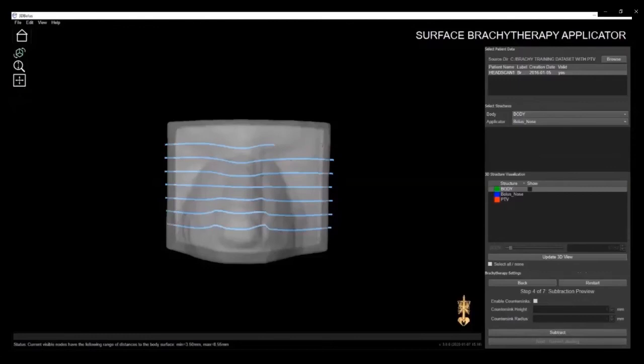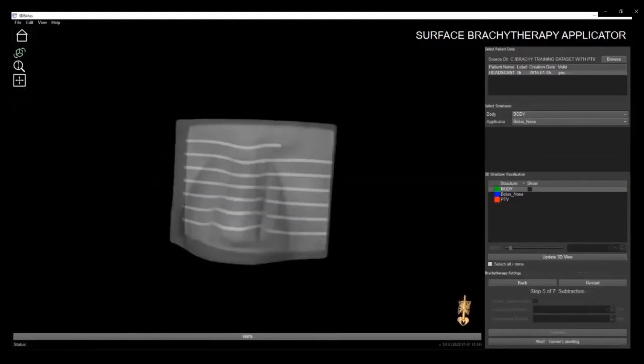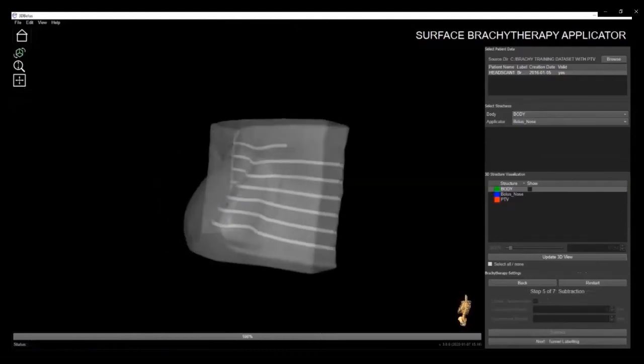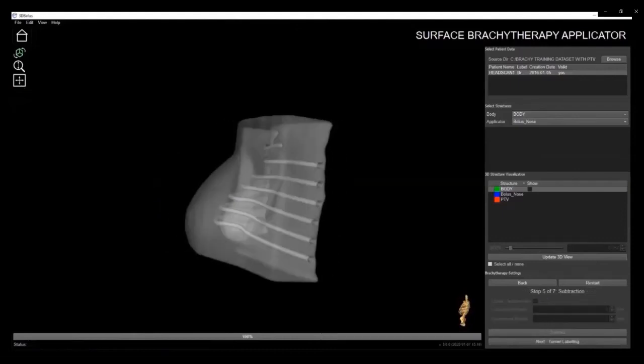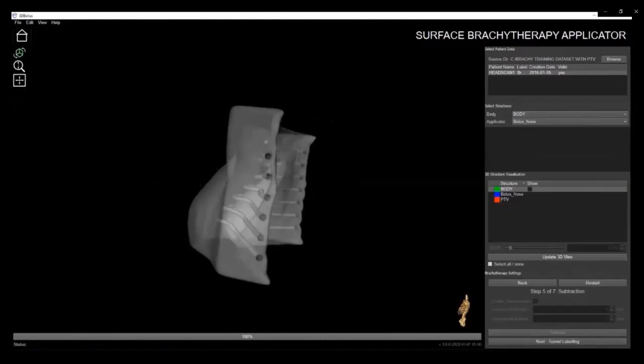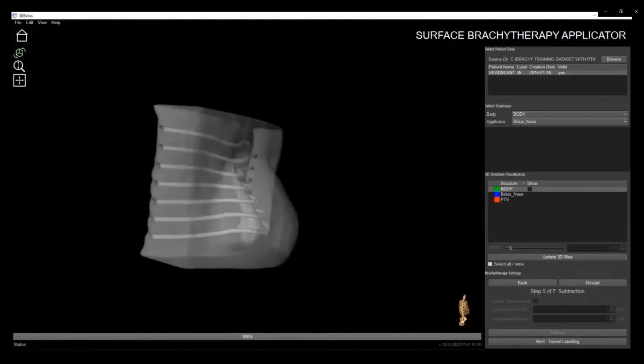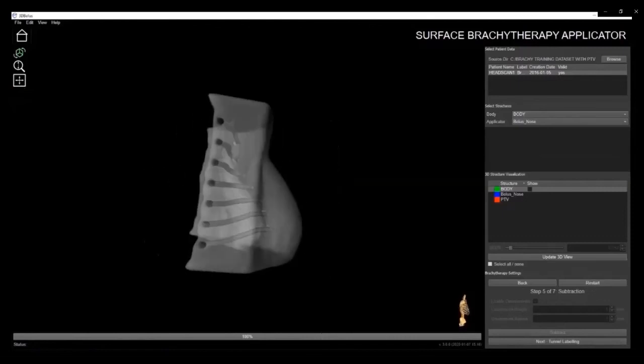Once the trajectory has been shortened, you can also add countersinks to the ends of each tunnel, where the height and radius can be manually adjusted as seen here. Adding countersinks to the ends of trajectories softens the tunnel exit and entry points for easier catheter placement. By clicking the Subtract button, you can see how the tunnels have been generated. In this case, the tunnel has been stopped partway through according to the parameters that were set and countersinks at the ends of each tunnel were generated.